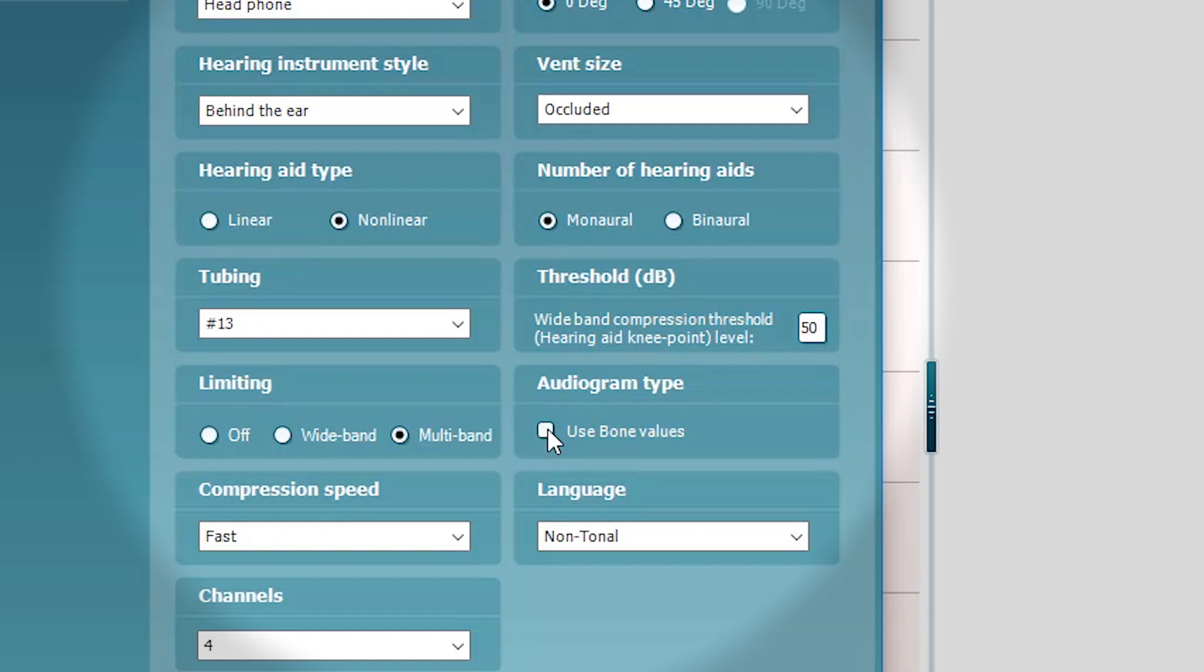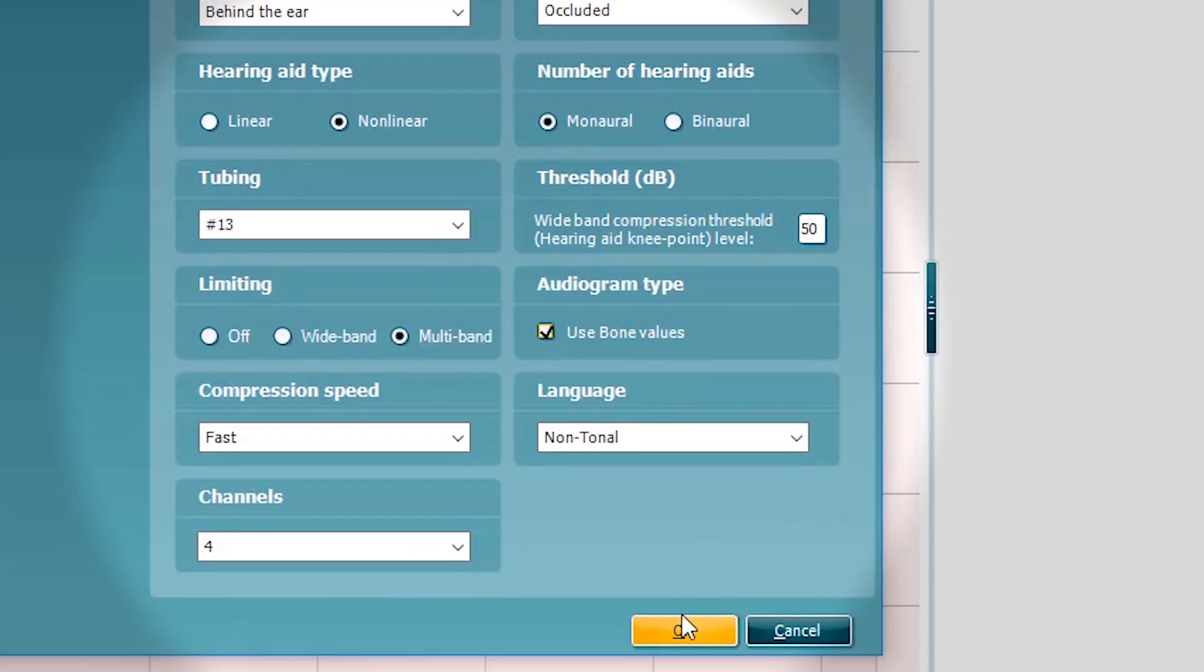If I wanted to now enable bone values as an example, I can click OK on that. I can also change anything else in here, so should I wish to swap to a binaural fitting where it's actually a monaural fitting in this scenario, then I could do so as well.